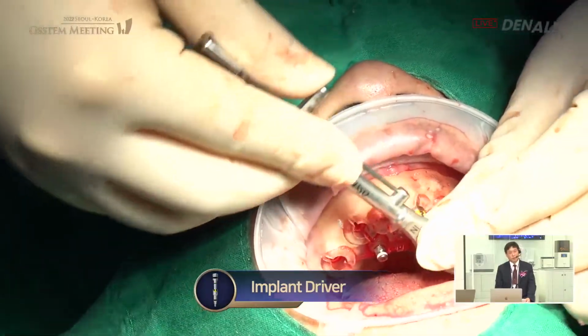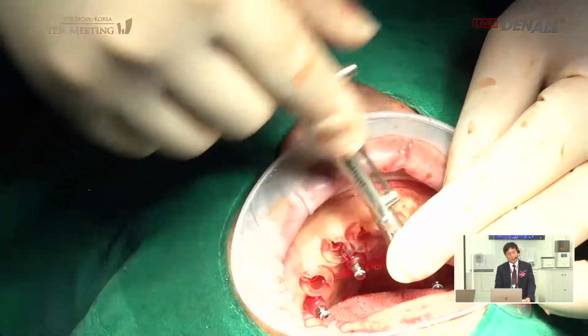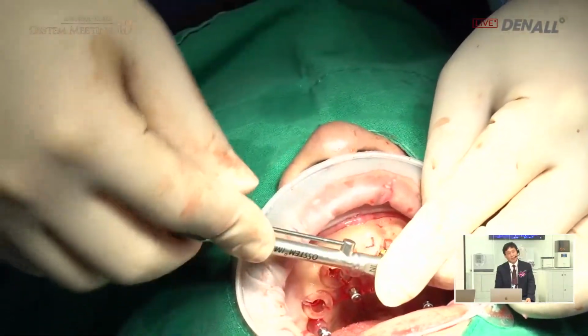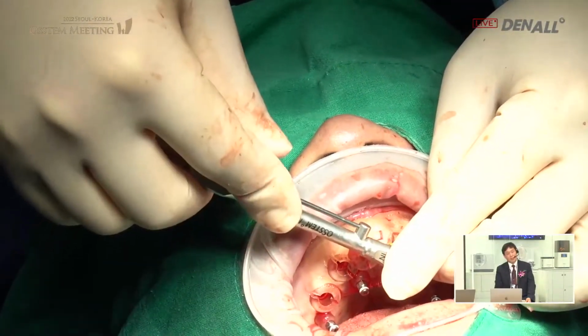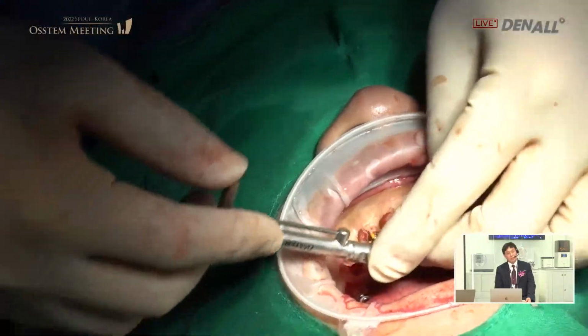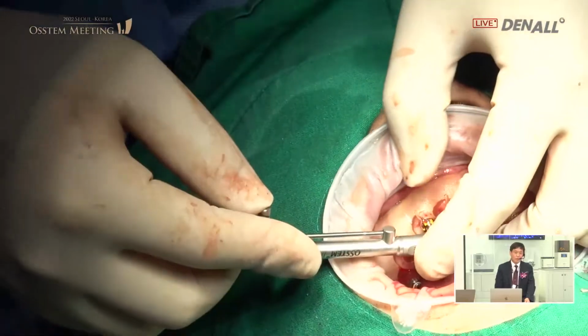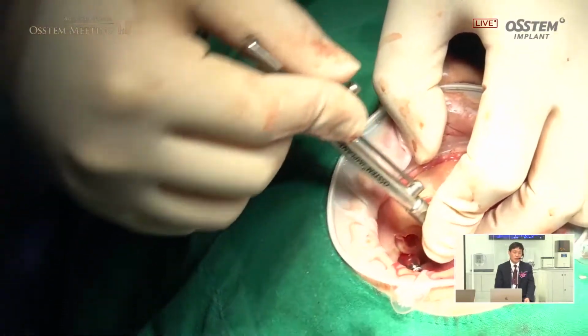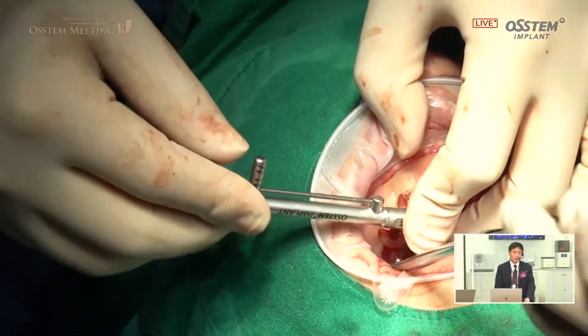From number 11, implant placement depth is being adjusted. Number 21. Number 13. How much is the primary stability?